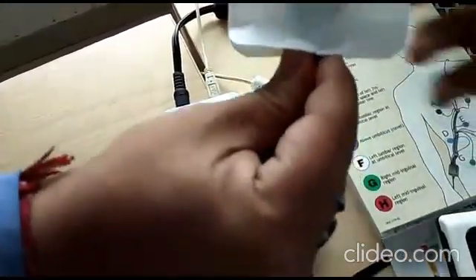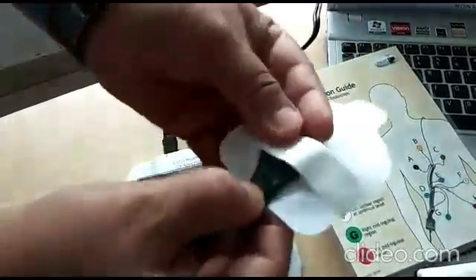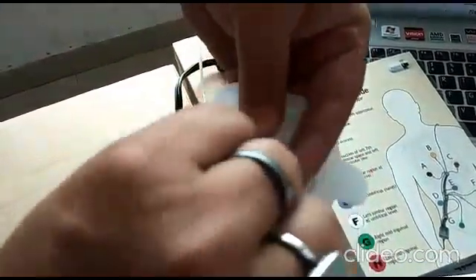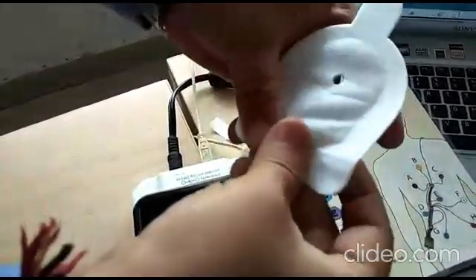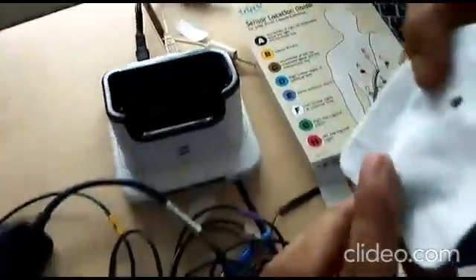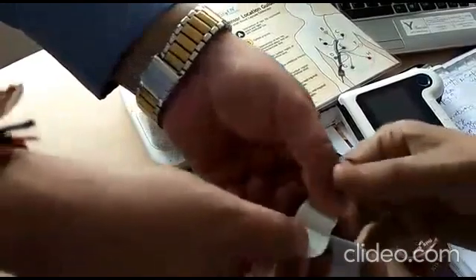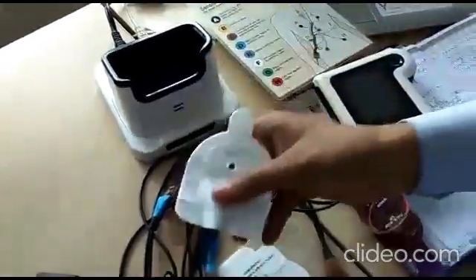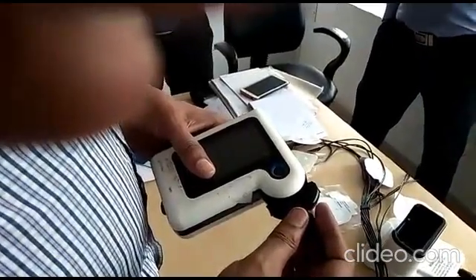We place all sensors likewise, making sure the center is aligned — it should be concentric. Thereafter, we remove the backing and paste it at the respective position. All eight leads are to be done in the same order, then fixed at their respective positions. The other end is connected with the arrow direction already indicated. We discuss how to connect the Data Recorder to the sensor leads.